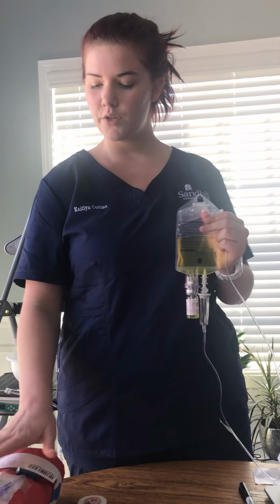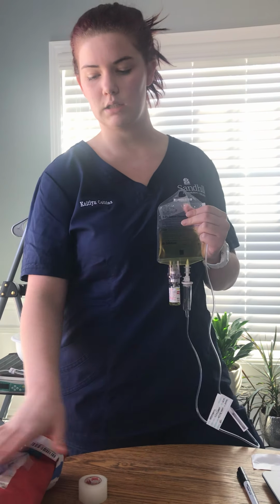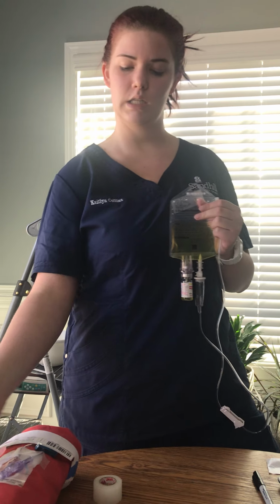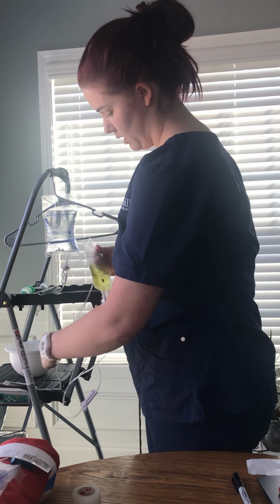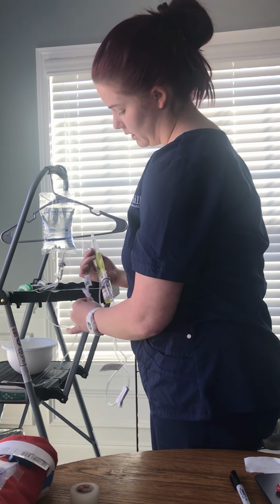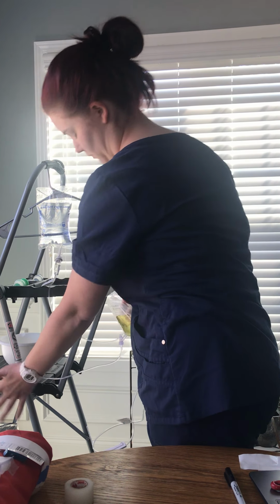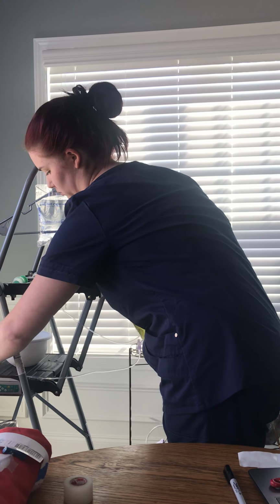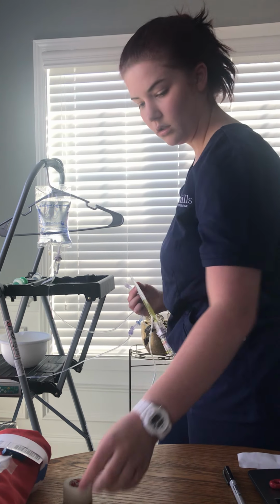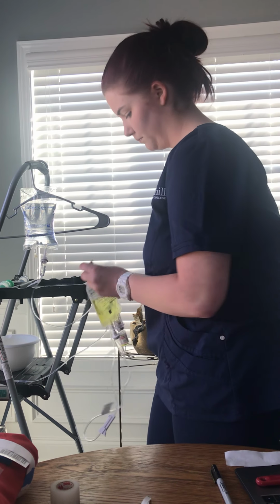There is no redness, swelling, signs of infiltration, or phlebitis noticed at this IV site, and the dressing is clean, dry, and intact. I'm going to pick my line here, and this is the Y side above my pump. So I'm going to clean it for 30 seconds with alcohol.